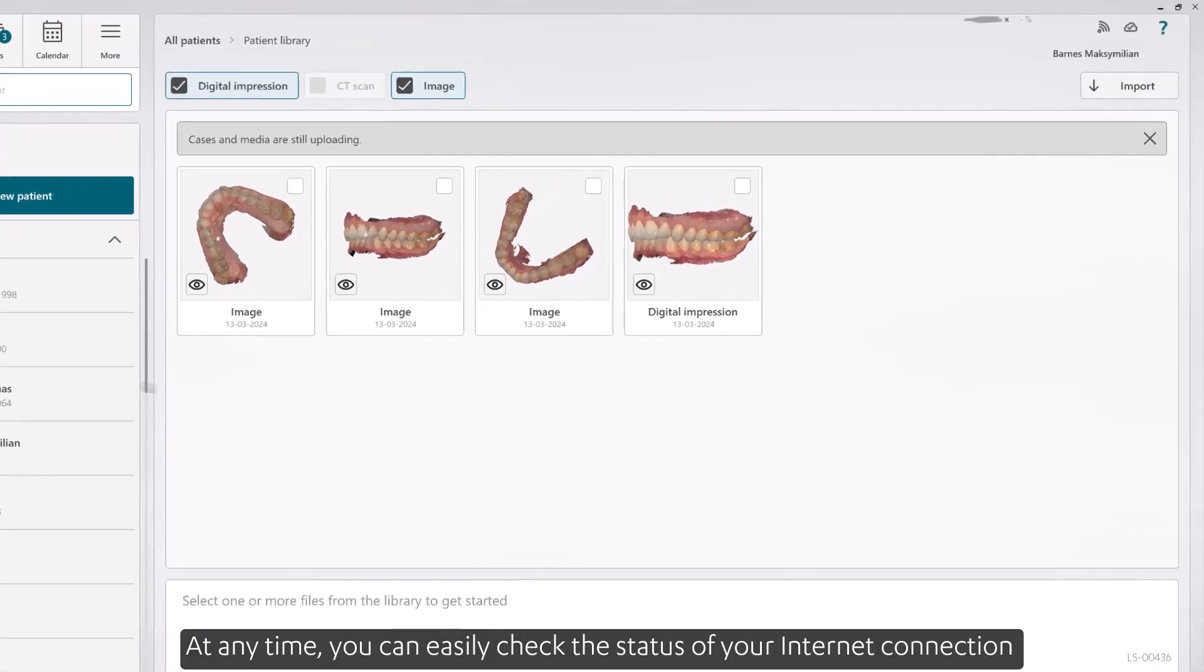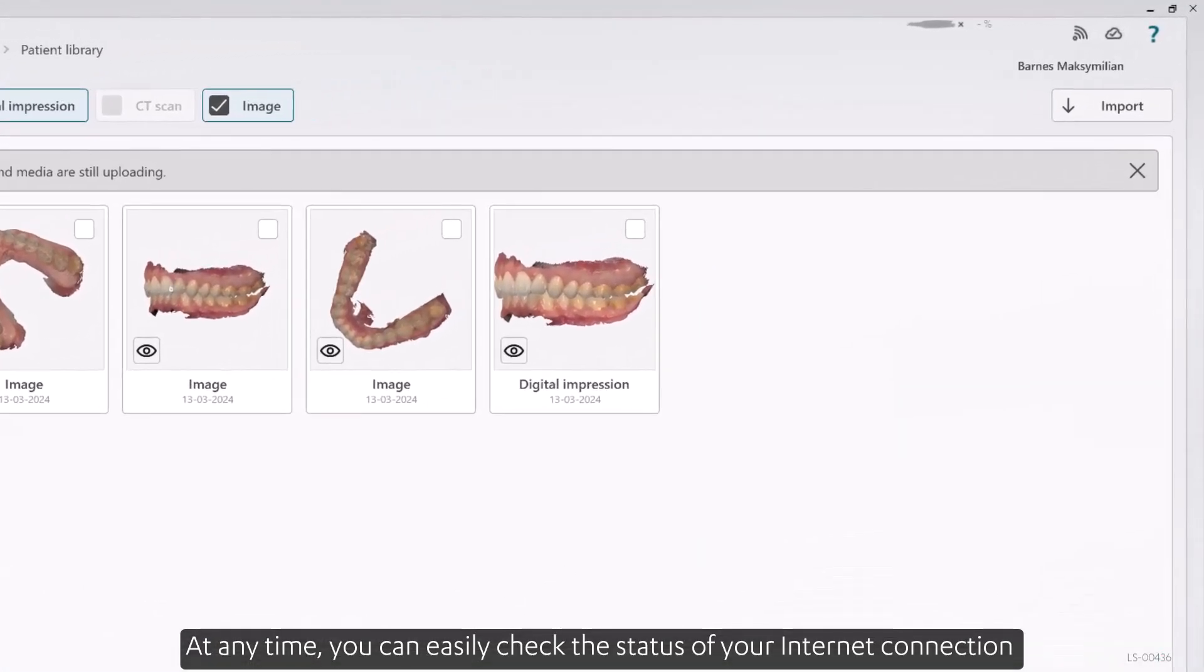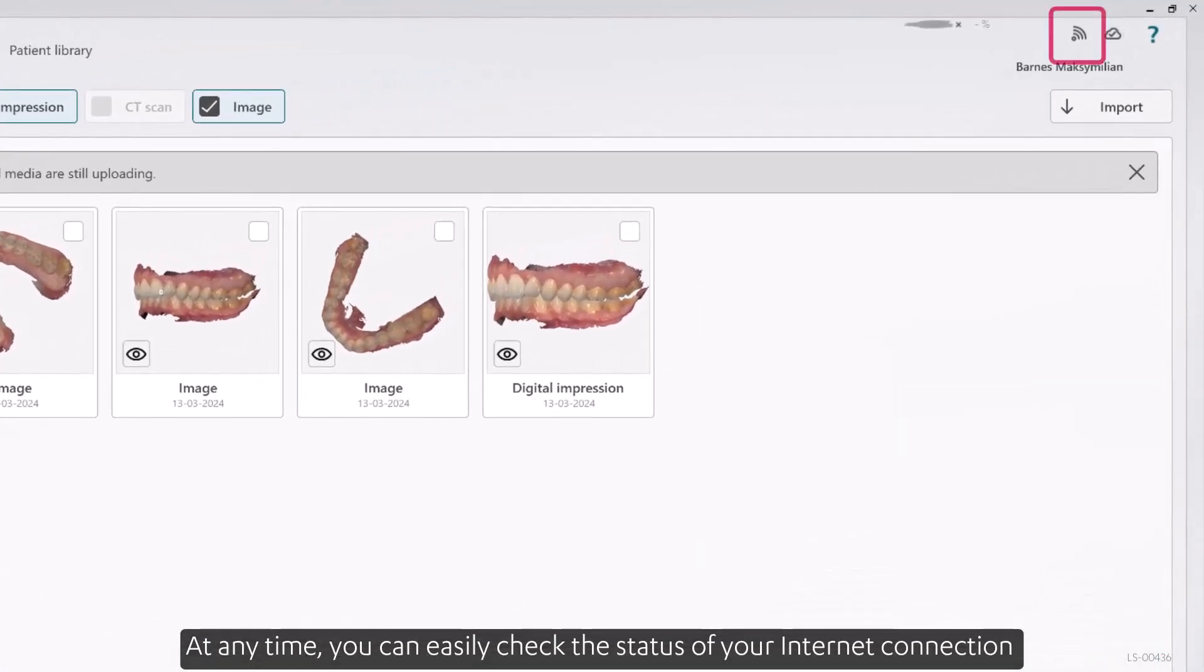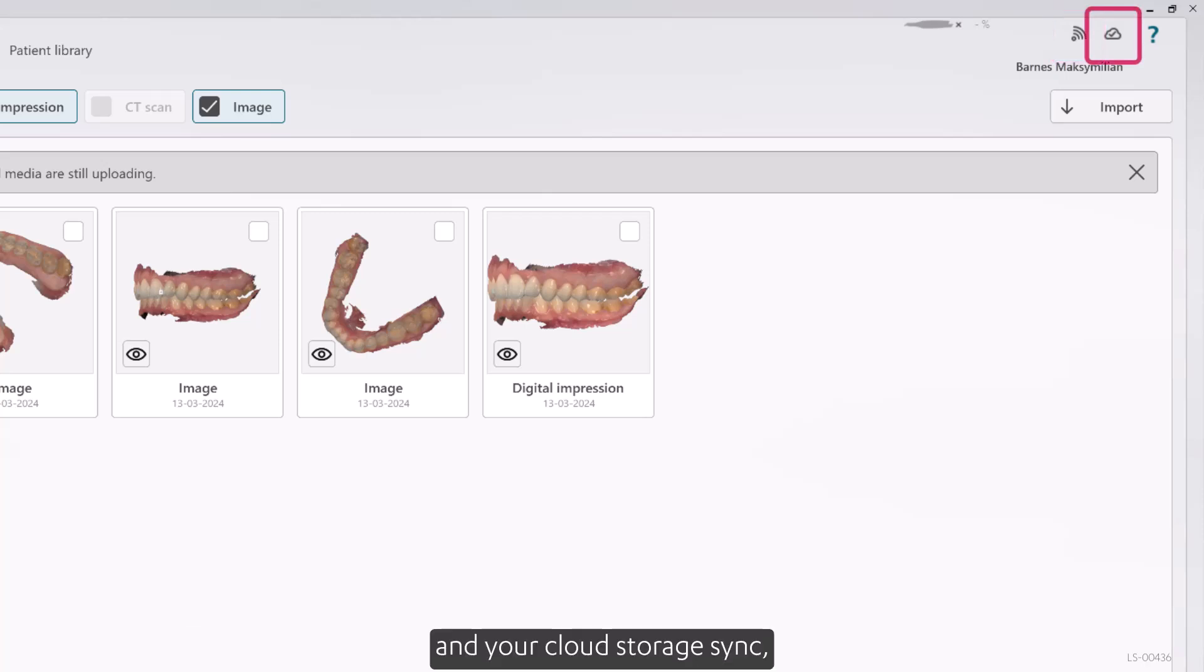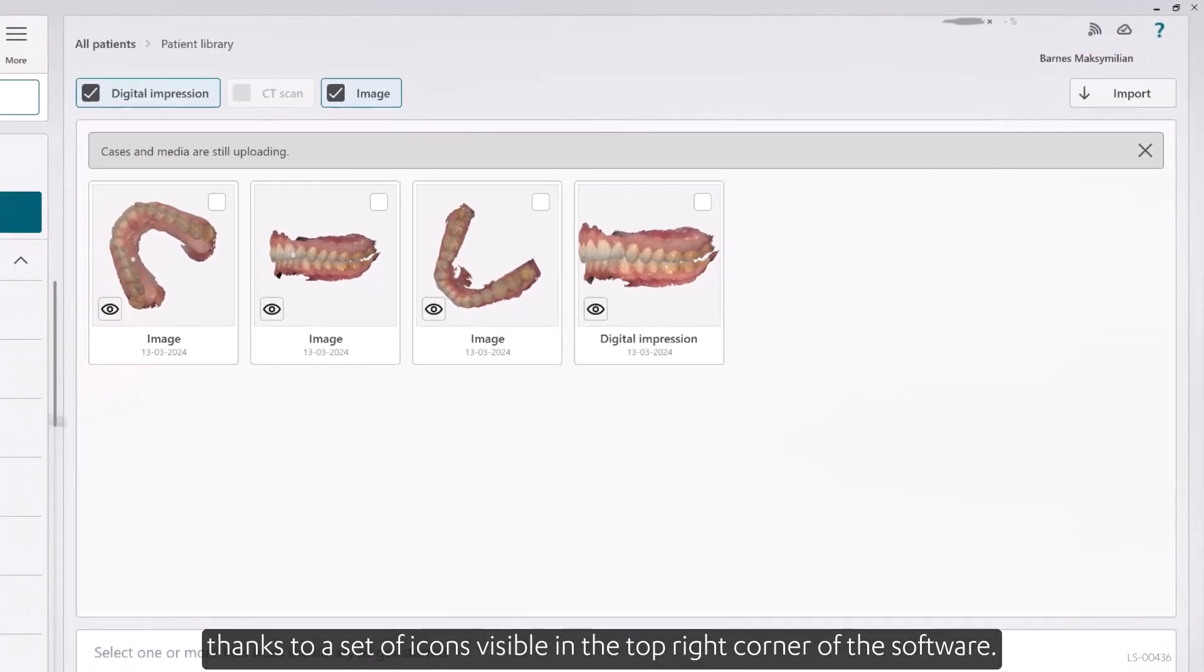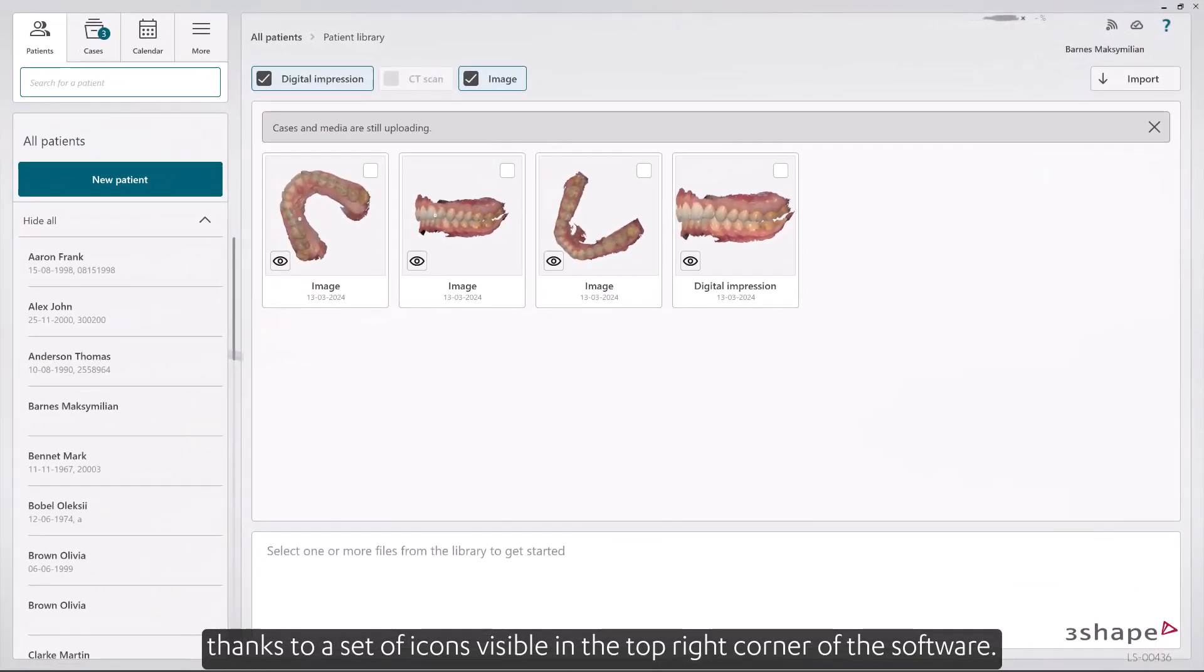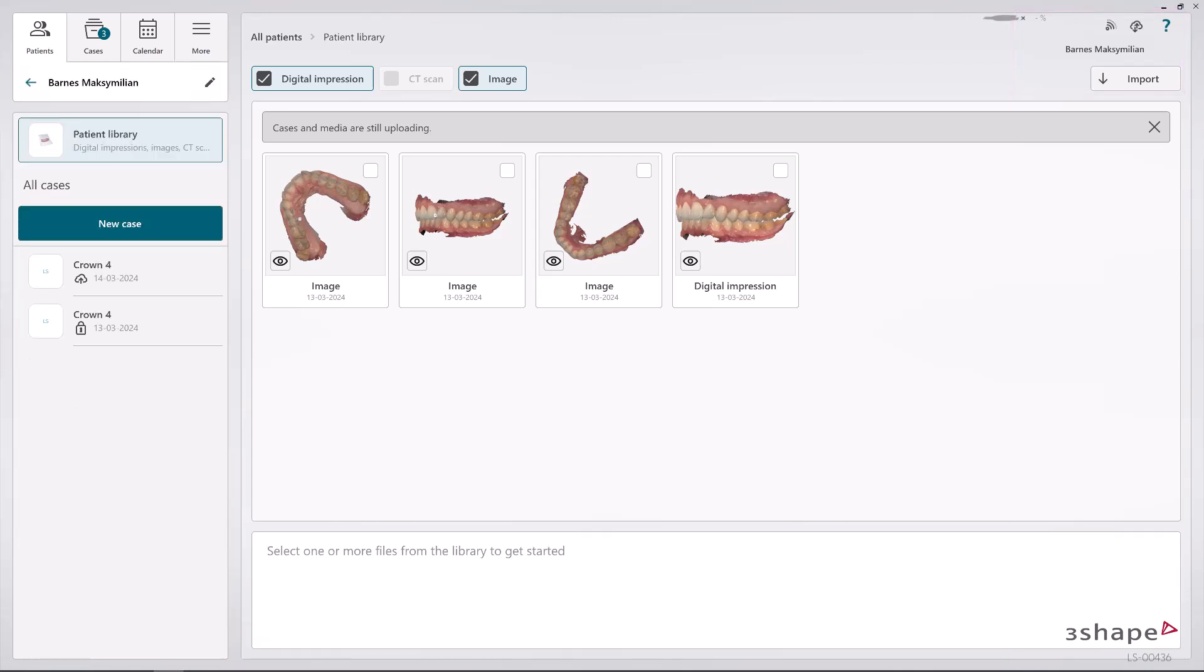At any time, you can easily check the status of your internet connection and your cloud storage sync, thanks to a set of icons visible in the top right corner of the software.